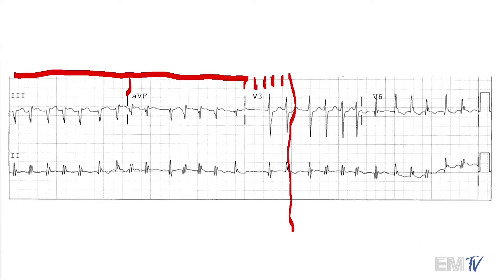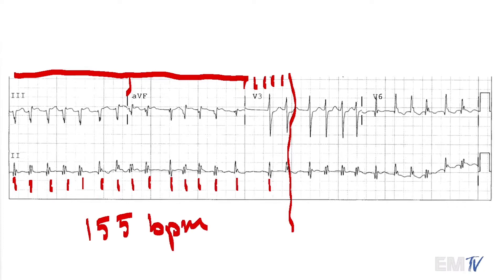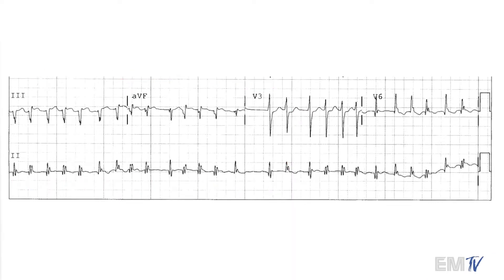Now that we've got our six-second strip, we can begin counting the QRS complexes and get our rate. I'm getting 15 and a half, so we'll call this 155 BPM. Now to identify the rhythm, the first thing I'll look at is the R-to-R interval.